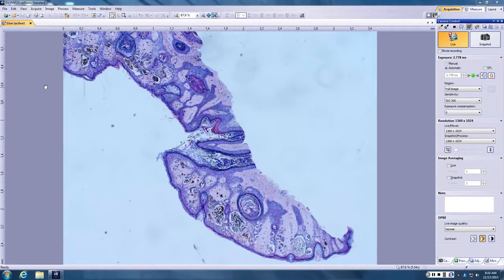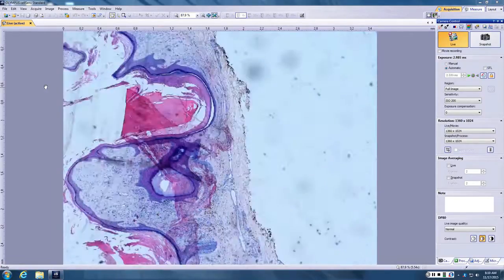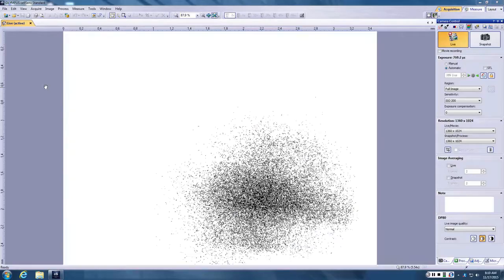So it's important to recognize for that reason. Reasonably small, well circumscribed. The only problem is the nests are big and they're poorly cohesive. But that's completely normal for any of the special site nevi.